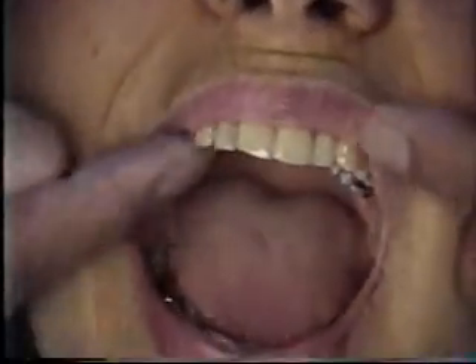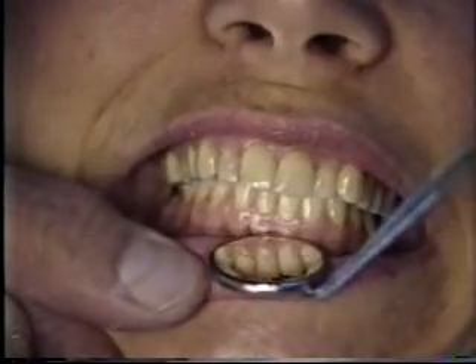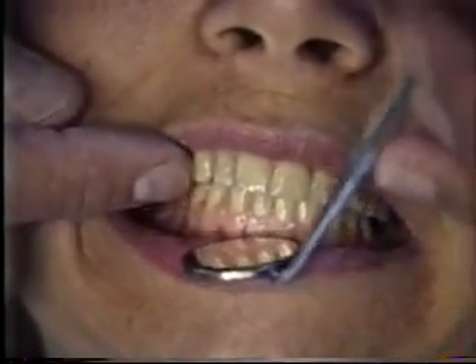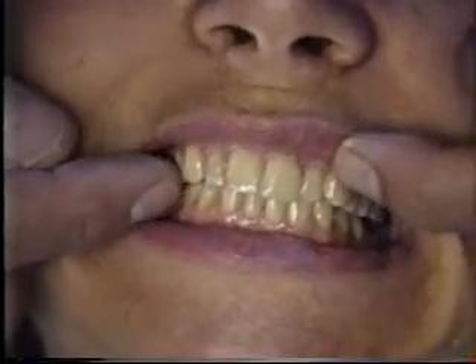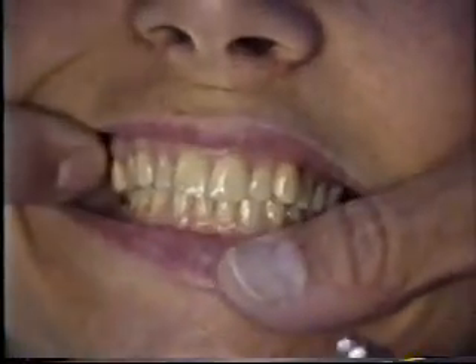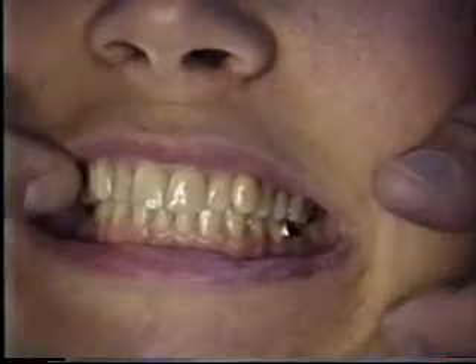So she's had a tremendous amount of wear. Put your teeth together in your normal bite, in your back teeth. There's a deep overjet as well as quite a significant overbite, and we find right here that the two laterals have been the teeth that have held her jaw forward. Then the bruxing problem has put her essentially in a Class II jaw relationship.